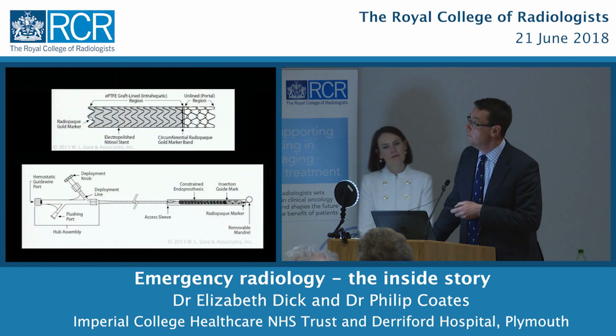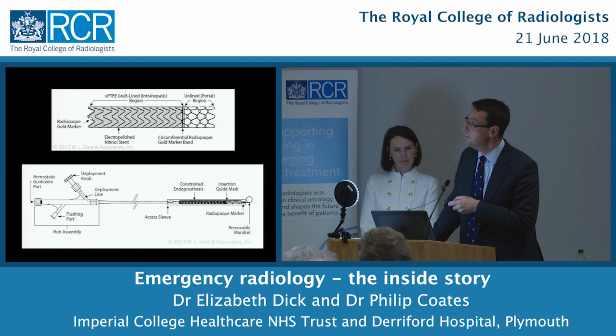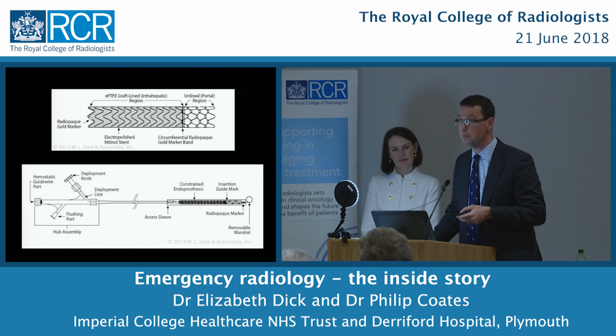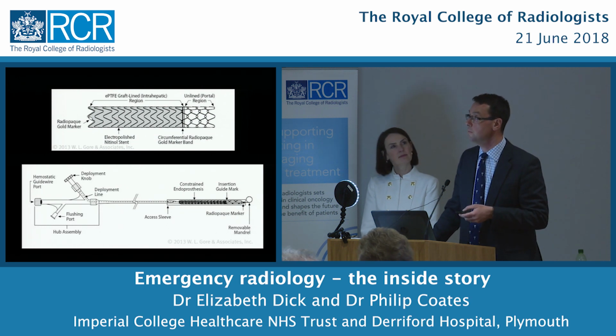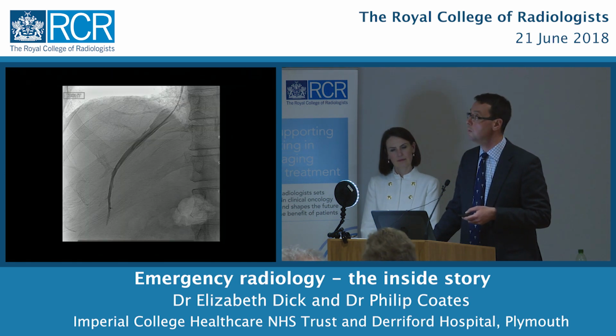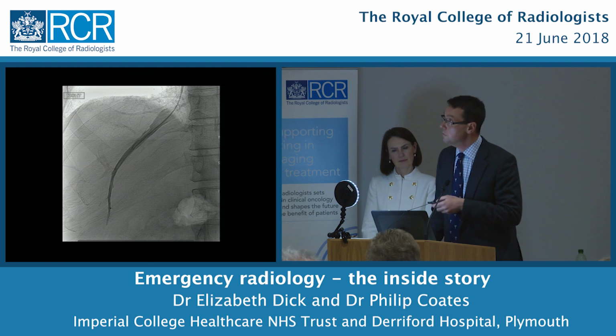So the stent graft comes collapsed on a deployment mechanism such as this, and this is all done through the veins in the neck. The access is made as a transjugular approach through the neck veins. The patient is brought to theatre under general anaesthetic because this is a traumatic and complicated procedure, and it can be quite prolonged. So my colleague Dr. Kafour has gone in from the neck here.